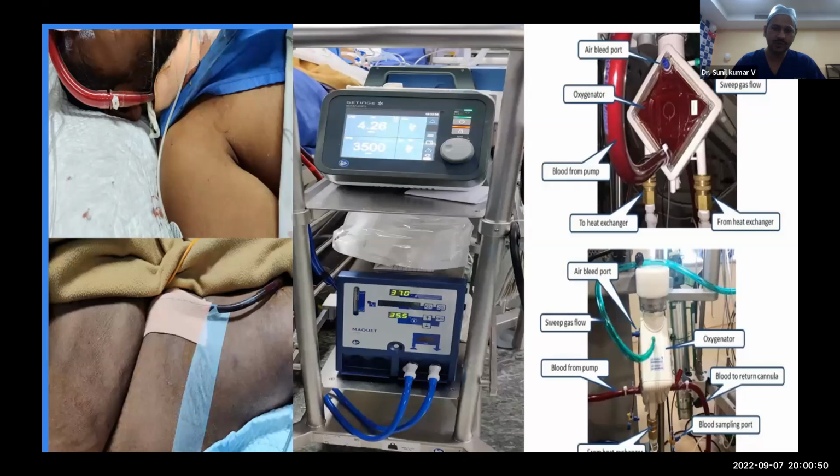So on the second post-operative day, the patient was taken to the theater. They inserted a femorojugular venovenous ECMO. As you can see, the drainage cannula is from the femoral side, and the return is to the jugular side. And this is the ECMO console we use, and this is the oxygenator on the rightmost corner.